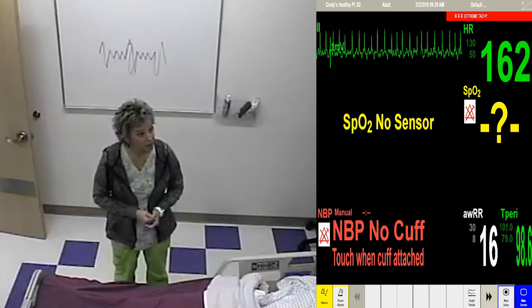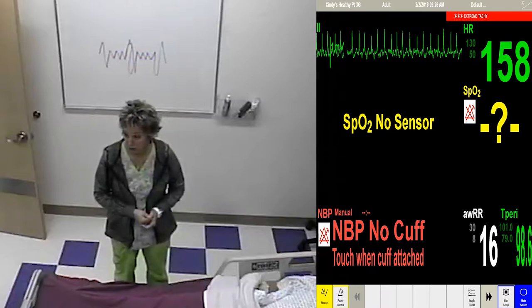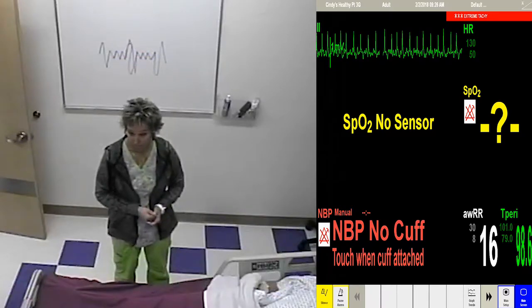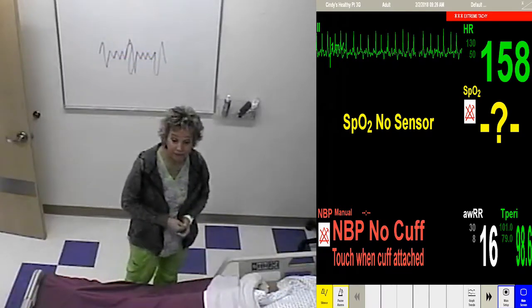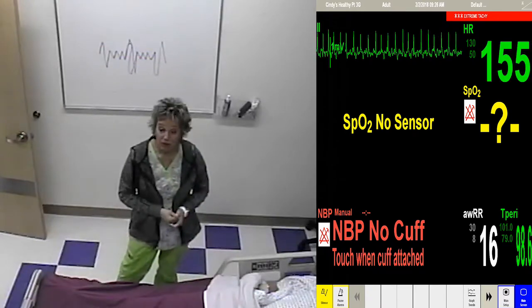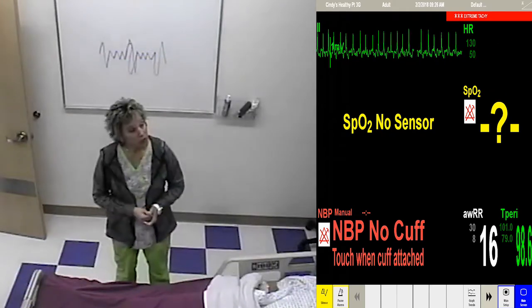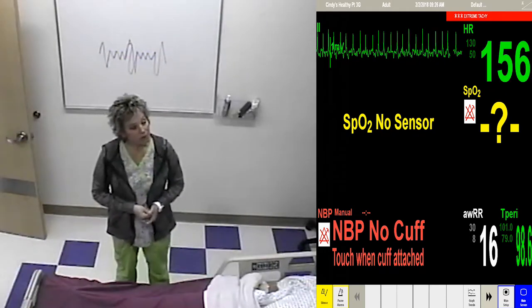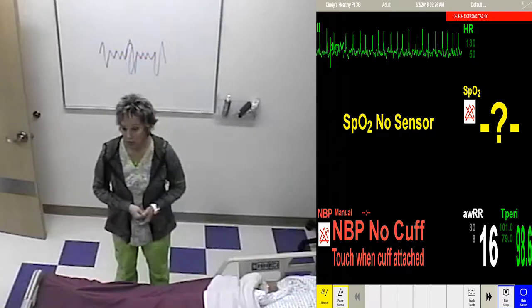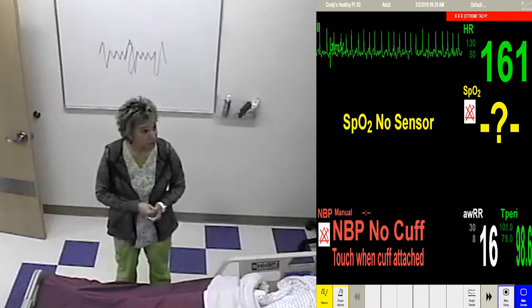No. Okay, so this one, any idea what this one is? A V? I'm just guessing. Not V-tach. You're close. AFib? Yes. So AFib. Atrial fibrillation. Okay. So remember, QRS comes from what part of the heart? The bottom part. Yes. Right? Okay.